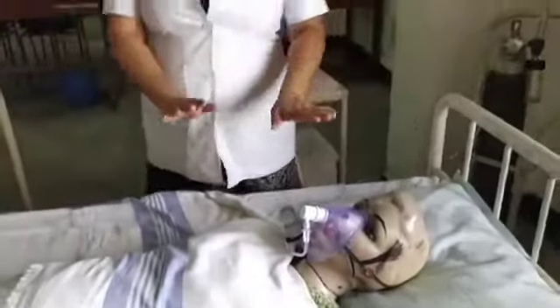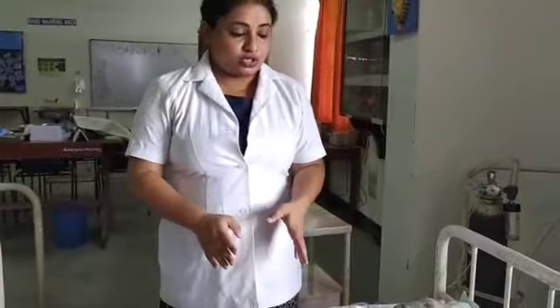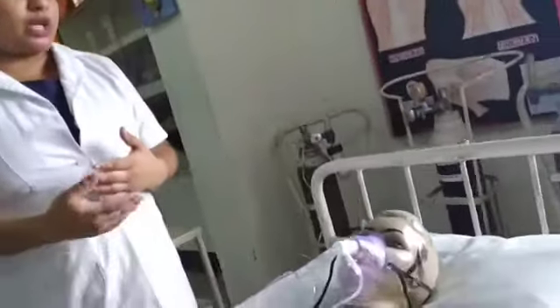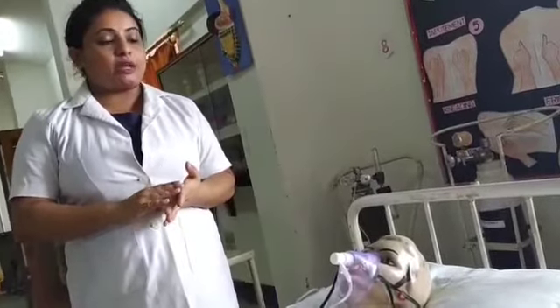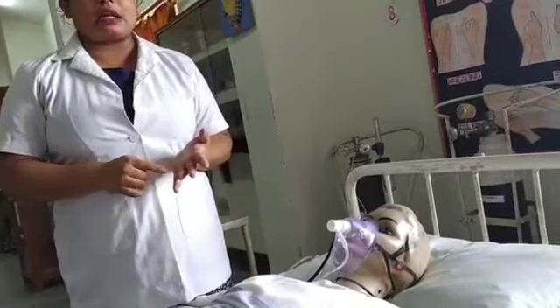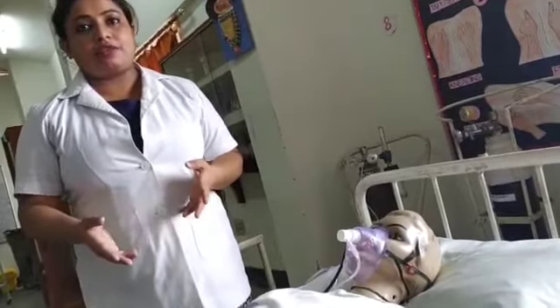It is very important to connect the pulse oximeter to check the patient's oxygen saturation, so we know the patient is getting adequate oxygen. After half an hour we have to check the patient's vital signs like pulse rate, SpO2, and respiratory rate, and if any complications occur we inform the physician. It is also very important to remember that during oxygen administration we must display a no smoking sign, as smoking near the oxygen cylinder is dangerous for everyone. Thank you all.